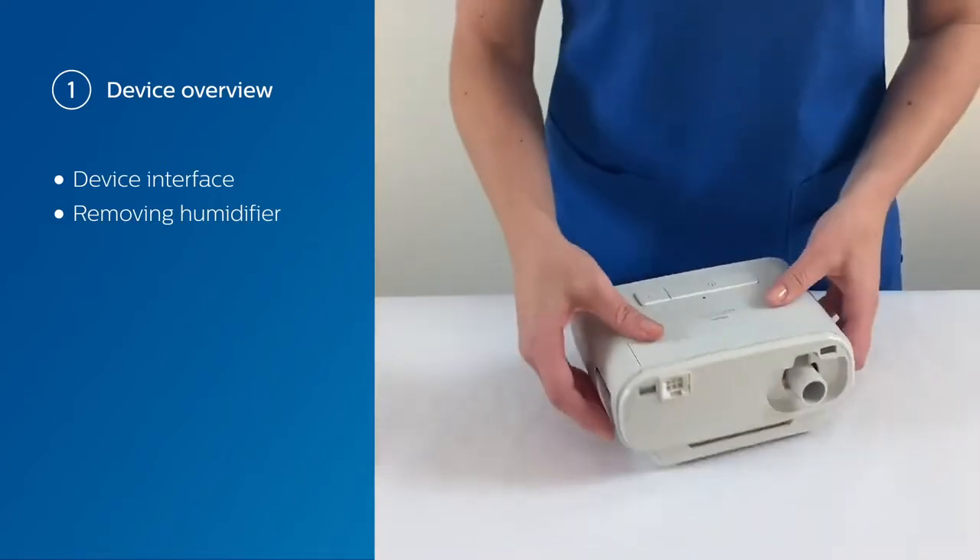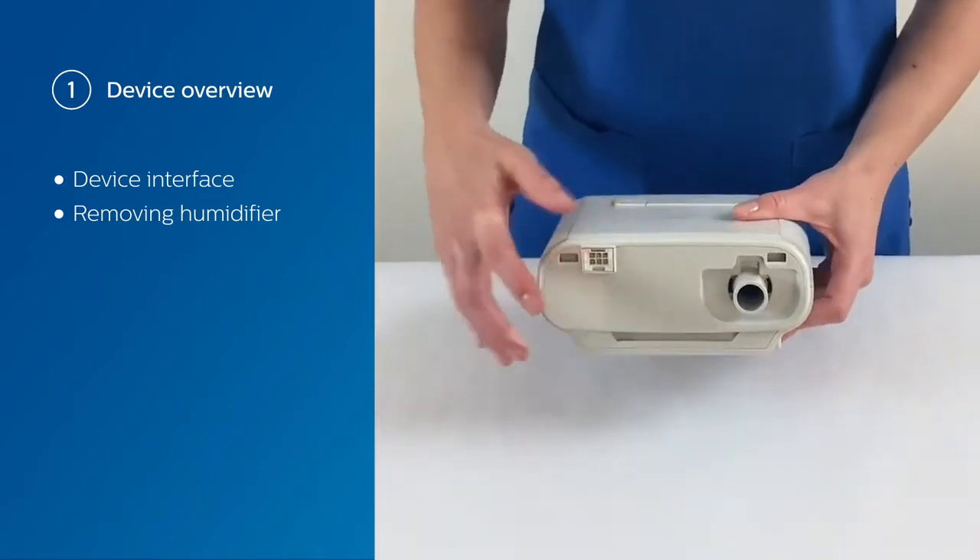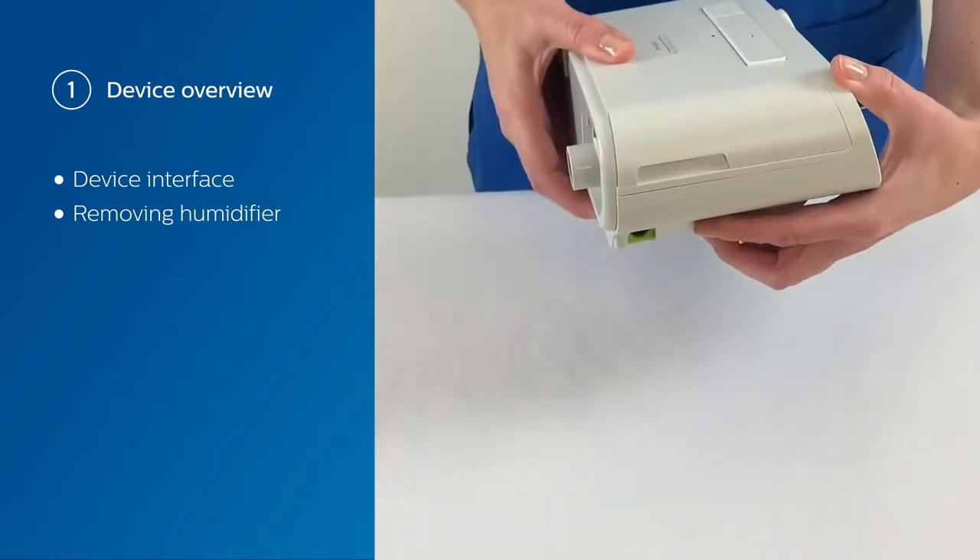As we turn the device around, you're going to see the humidifier connection, your air outlet, and your power connection.